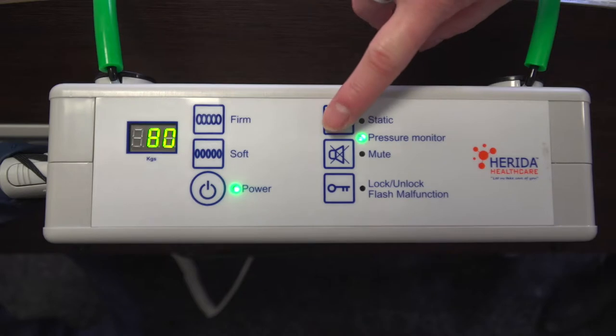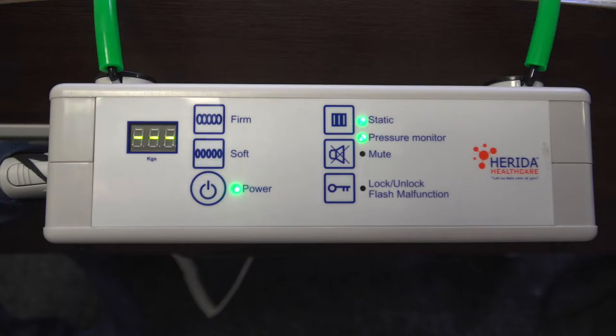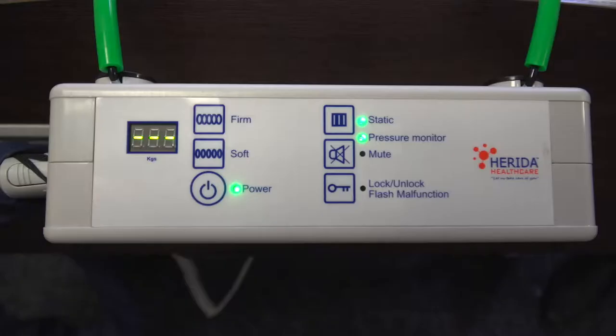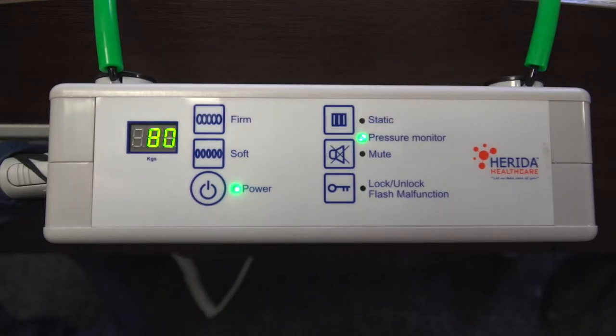Pressing the static button on the pump's control panel will stop the alternation cycle and both sets of cells will remain fully inflated. When static mode is active, the top LED light and the pressure monitor light will be illuminated. Static mode allows clinical procedures, site transfers, or any other procedure to occur. Simply press the static mode button again once the panel is unlocked to switch it off. As a safety function, the system will automatically revert back to the alternating cycle after 25 minutes.